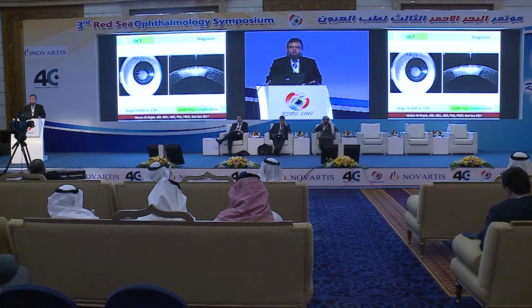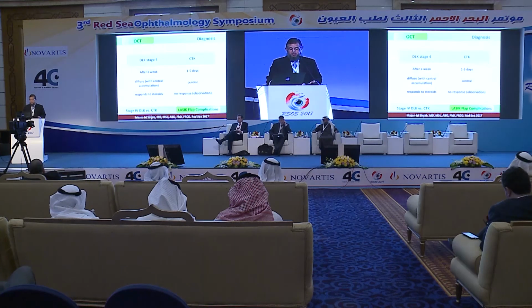The DLK shows a diffuse opacity, but more centralized and not full thickness in the cornea. It is just in the interface. So by the OCT, you can differentiate between these two entities, in addition to some clinical clues. DLK stage 4 comes after a week, while the CTK comes in the first couple of days.